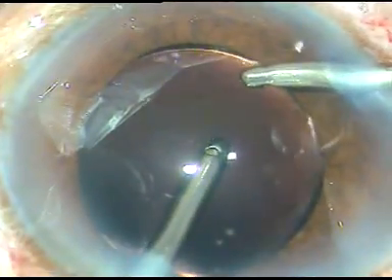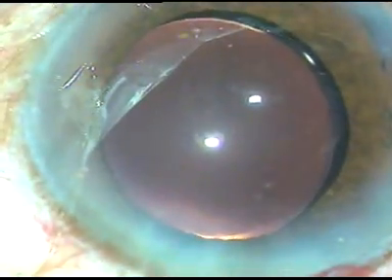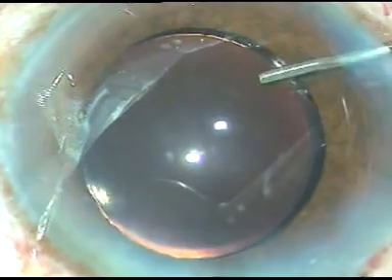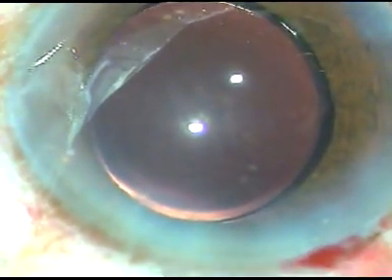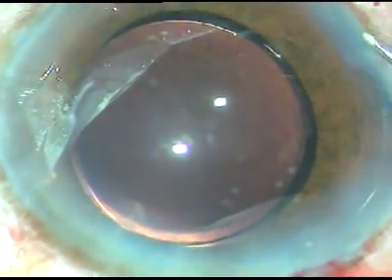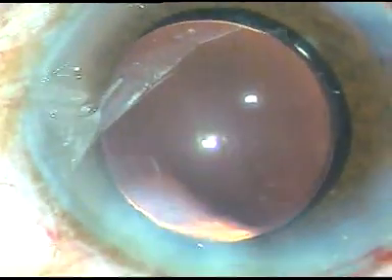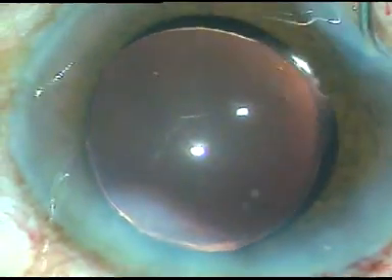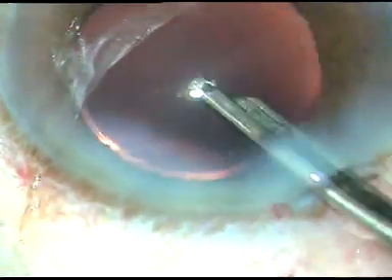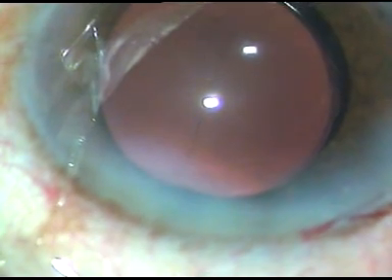At this moment I am using the irrigating probe to remove the viscoelastic substance from the capsular bag. Now irrigation and aspiration both are being used together. So dear colleagues, we have to take challenges — unless we do some challenging cases, we can't improve our skills and we can't go to the next higher level of competence. So I encourage you to take on challenging cases. The side ports are hydrated, the final anterior chamber lavage is done, the anterior chamber is formed, and the case is concluded. See how beautiful the main incision is — there is no wound burn.